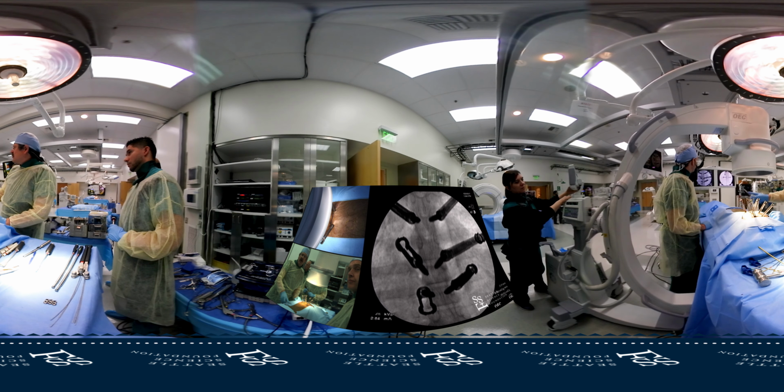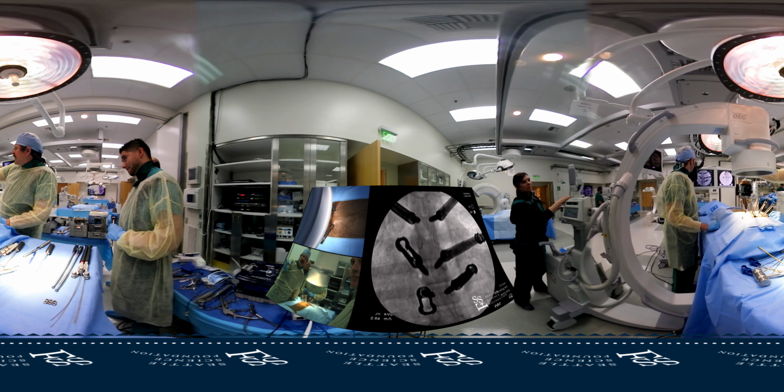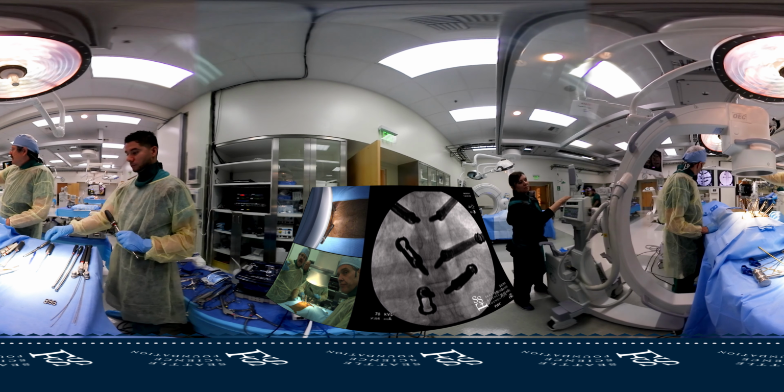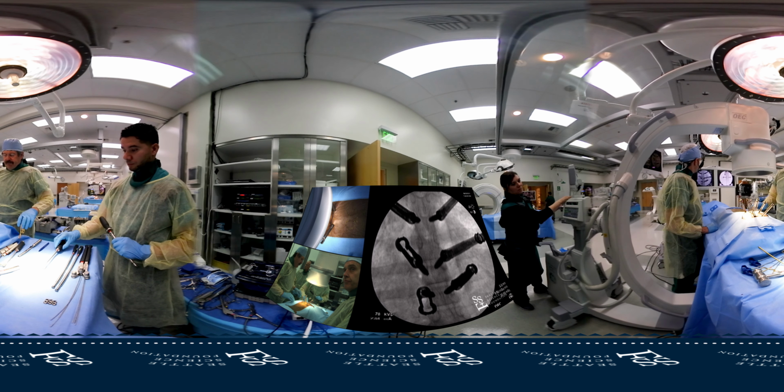So that's what it'll look like. You can see the others, despite being deep into the body, are either right at the medial border of the pedicle or just medial to it. Those other screws are all very safe. The other screws look perfect.